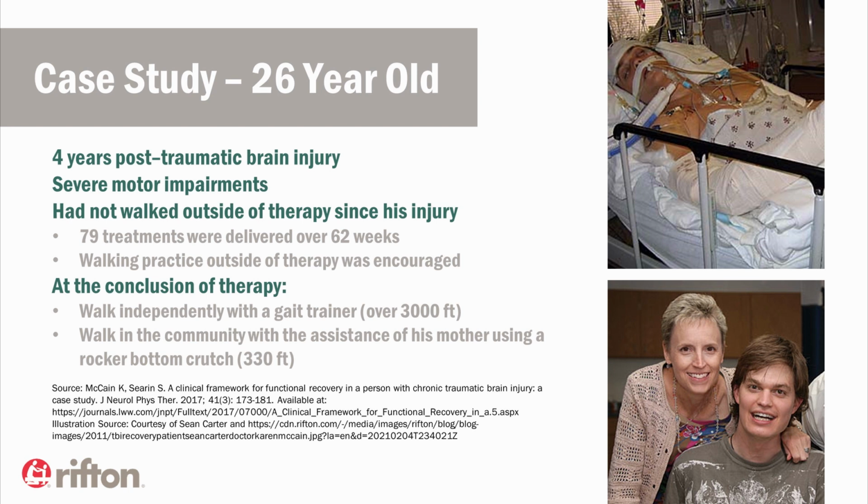The patient received gait-related interventions in a variety of means delivered over a year and 2 or 3 months. And even outside his therapy sessions, he did walking practice with a Rifton pacer. On the next slide, we'll see a video showing the initial progress he made over less than a 3-week span, and then subsequent videos showing his progress after a year.